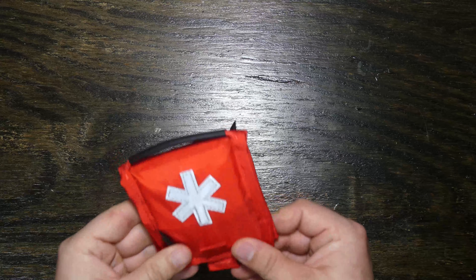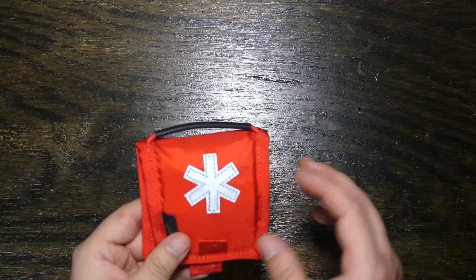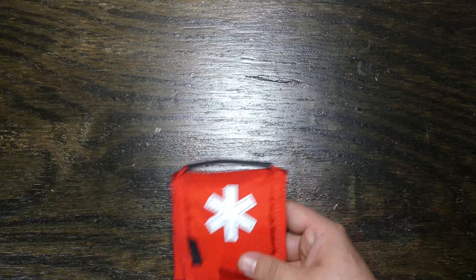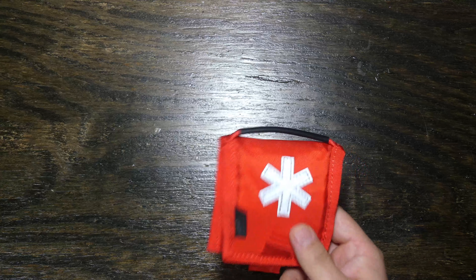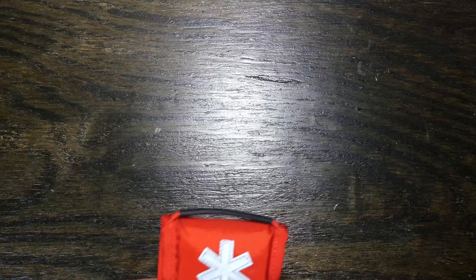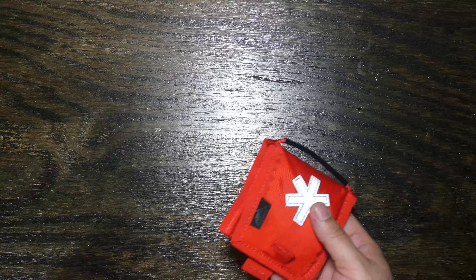It's got enough room for just some minor little basics to handle minor little stuff. This is a first aid kit and that is it. Now the pouch itself is about $10 and I'd say the contents are probably another $10.